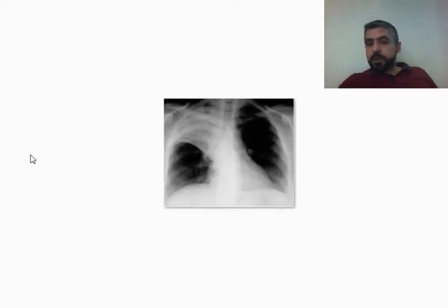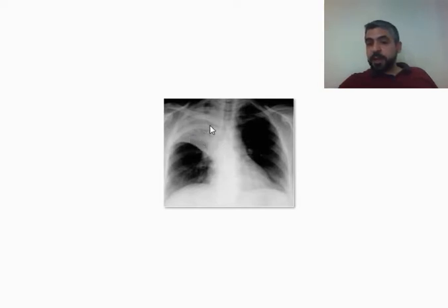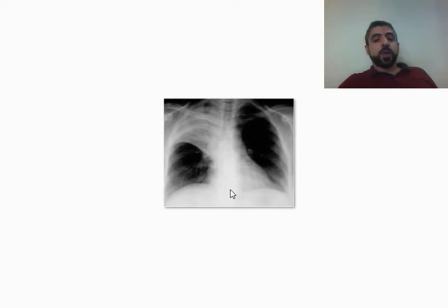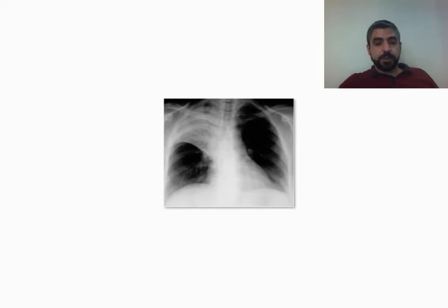Another example of lobar consolidation: the transverse fissure is pulled upward, the right upper lung zone is white, and it contains some small thin lines indicating air bronchogram. These are the features of right upper lobe consolidation-collapse — it is consolidated and transforming into a collapsed lobe.